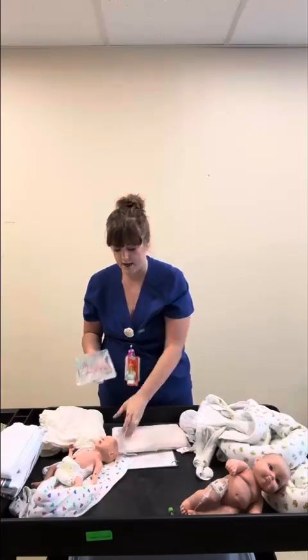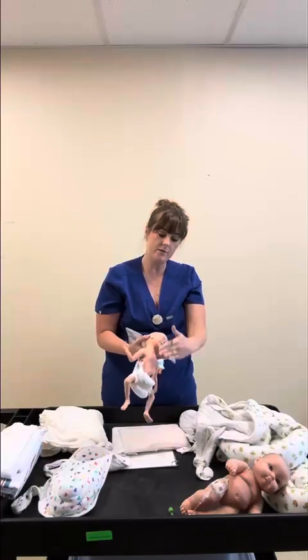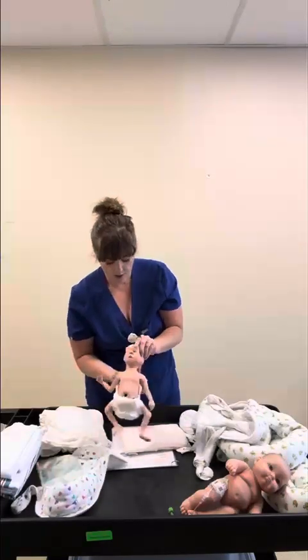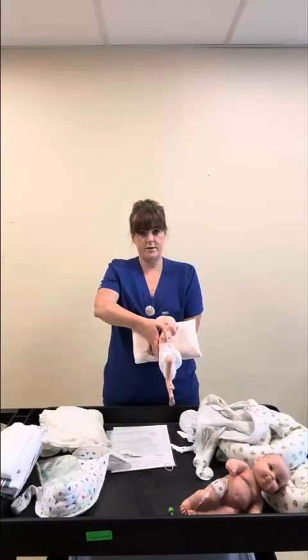You can also utilize this under the head for side lying for CPAP babies if you're having a hard time with the gel pillow and the posts pushing on the baby's head. So you can try to get creative and have the baby only on the corner of it, and then the post maybe sticks out. But if that's really not working, these are fabulous because you can create a tunnel for that tubing and still kind of position your baby.